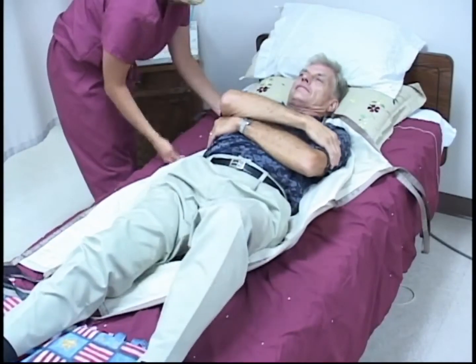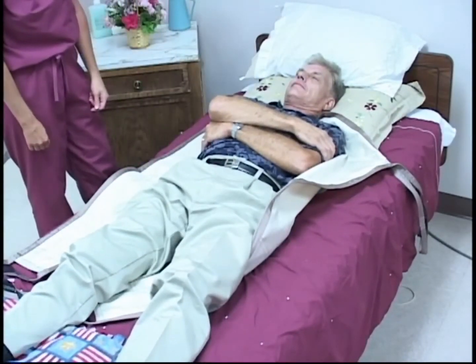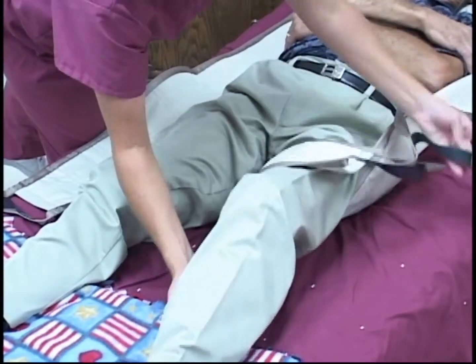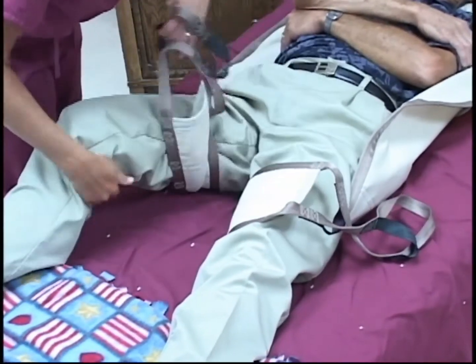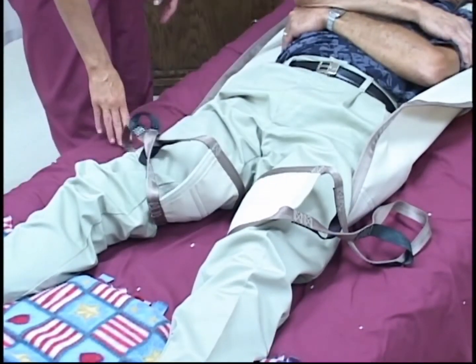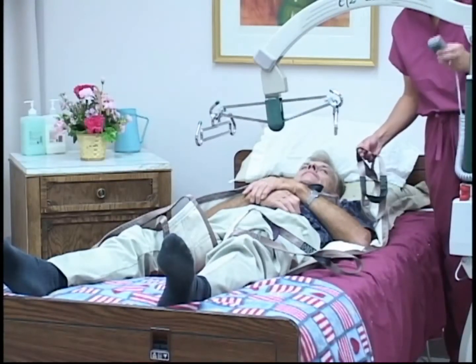Lay the patient on their back. Make sure the sling is centered underneath the patient. Lift the patient's left thigh and pull the left wing of the sling under the patient's thigh. Then place the excess wing over the top of the patient's left thigh. Repeat this step on the right thigh. When you are completed, the patient is now ready to be lifted.